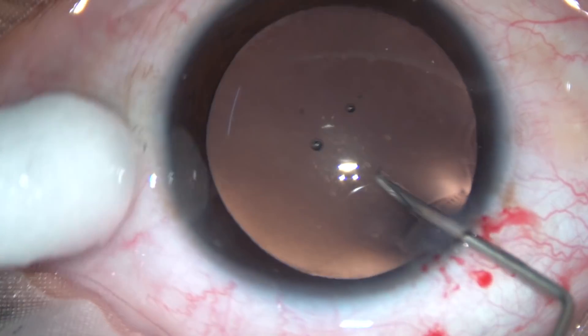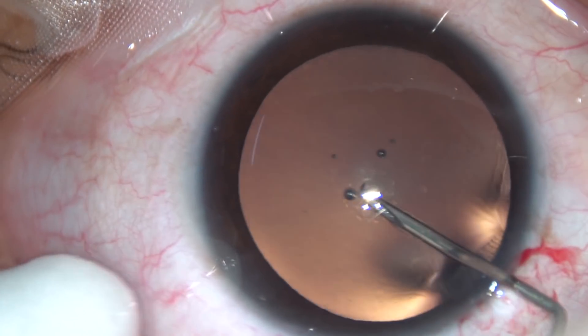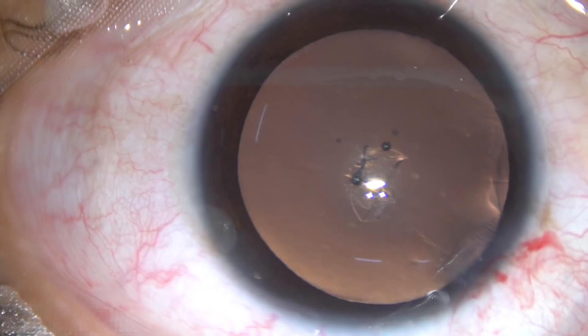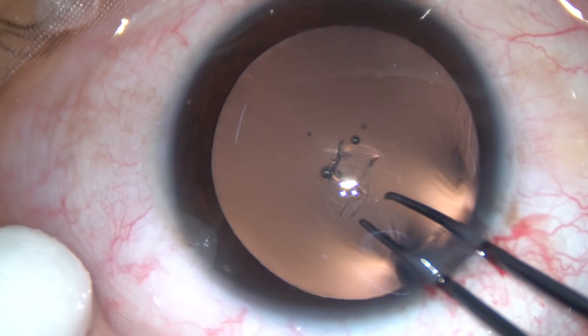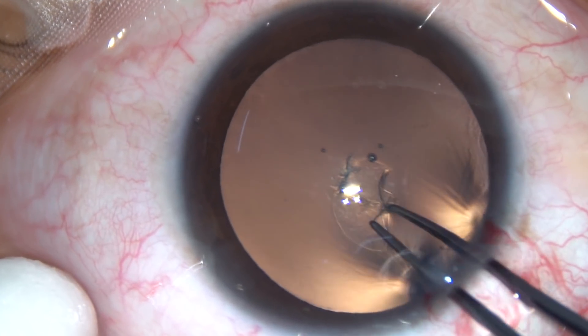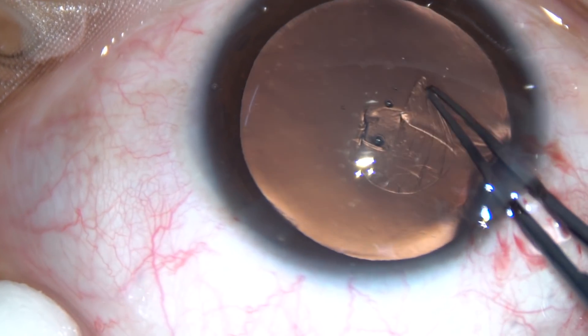Now, capsulorhexis. The capsule is incised with a 26-gauge bent needle. I then use the Utrata forceps to hold this capsular tag and go anticlockwise.